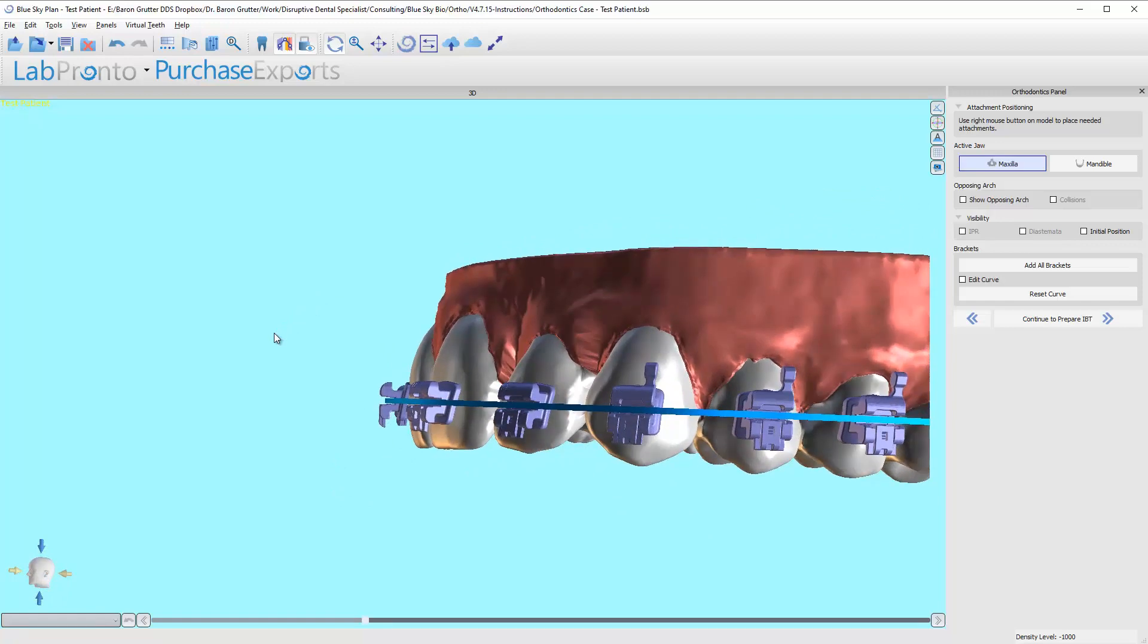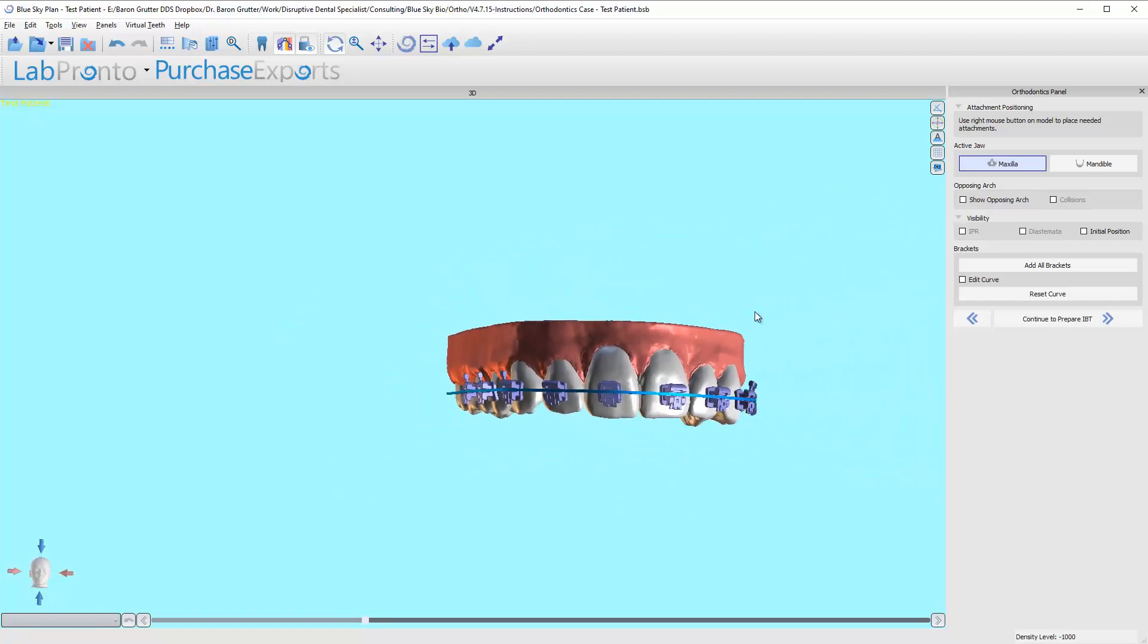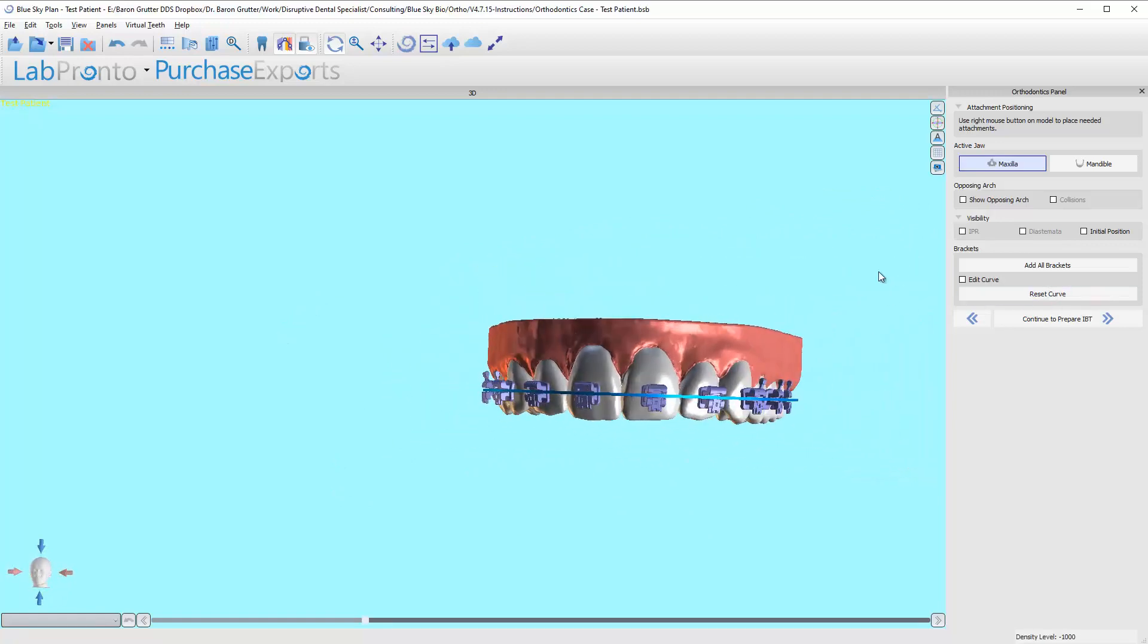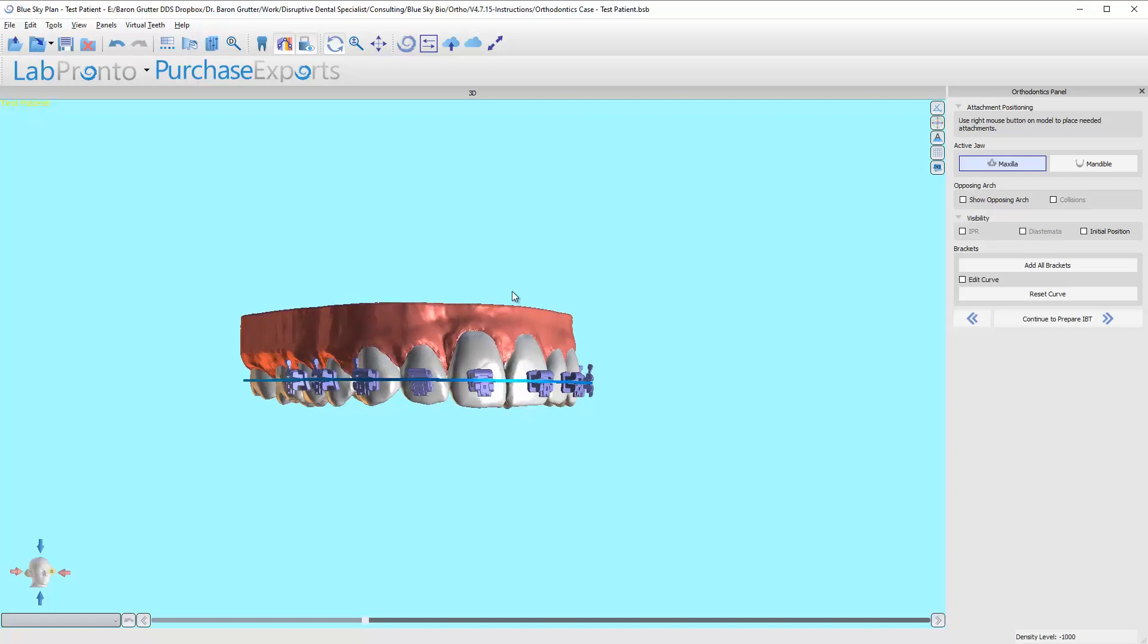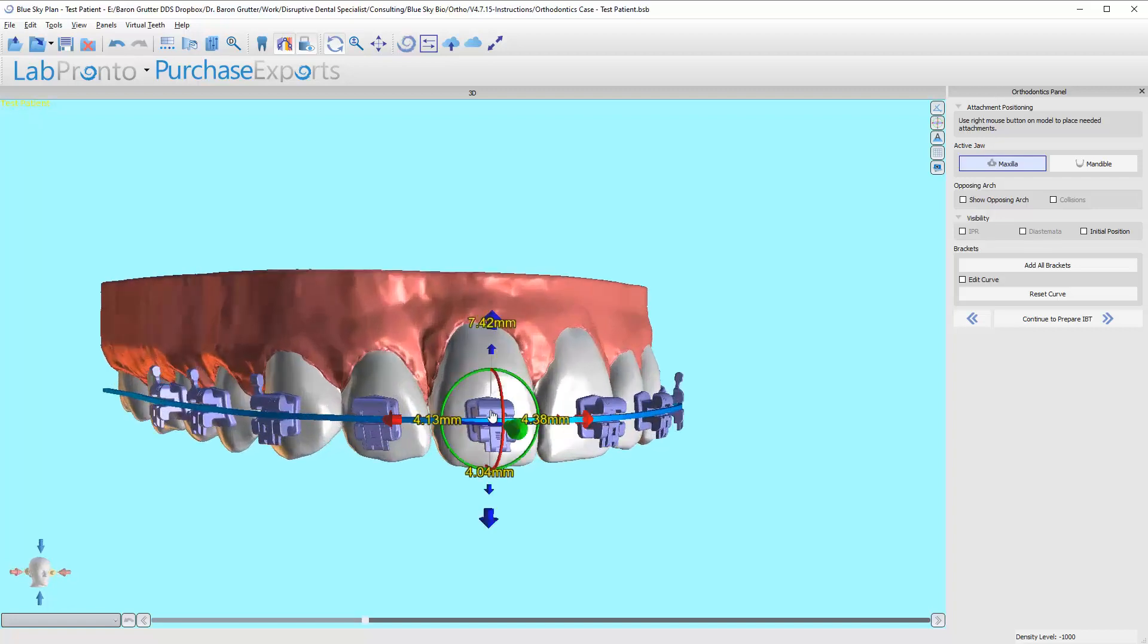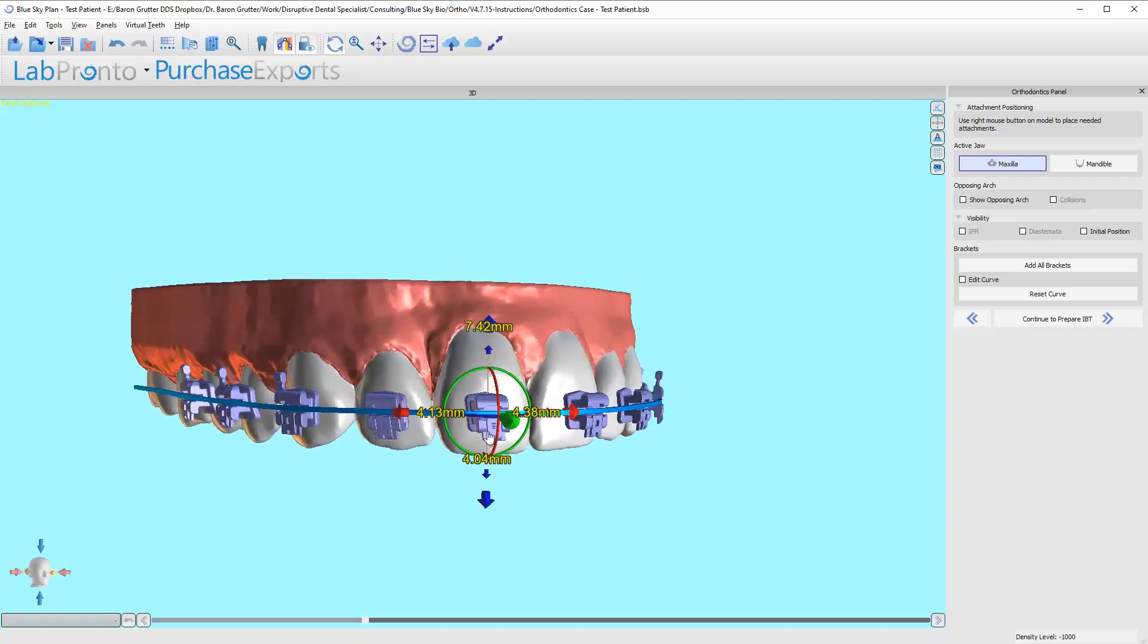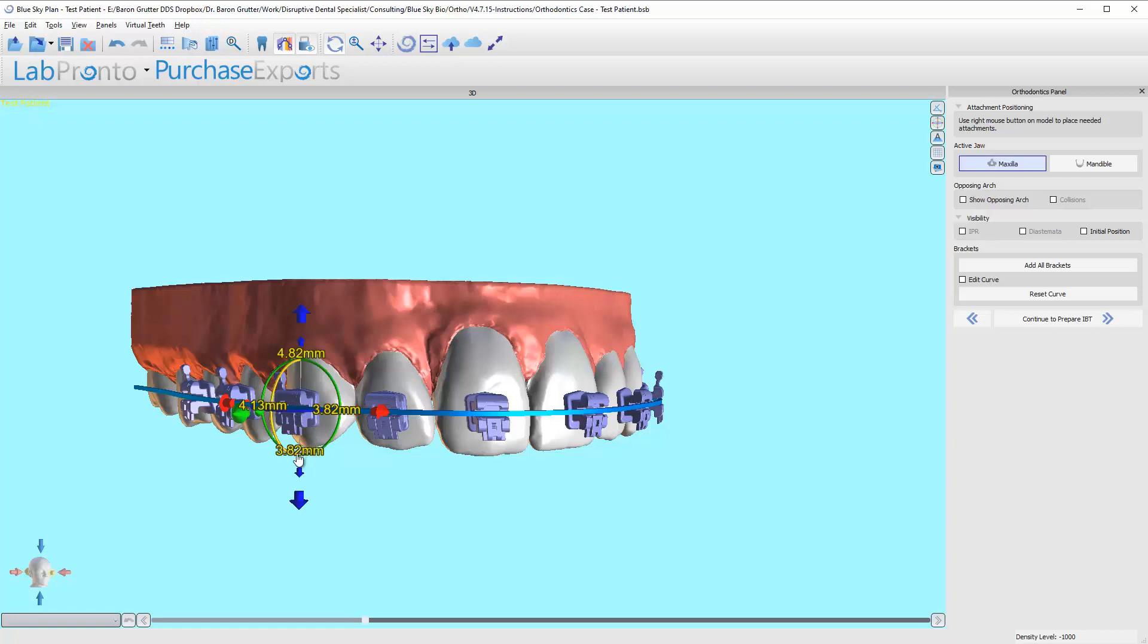Since you didn't do that, the software is going to assume that you put the teeth where you want them. And at this point I'm all done. I don't have to do anything. Any changes, you can come in here and you can see the measurements, how far away the bracket is from the incisal edge, and you can move if you need to.